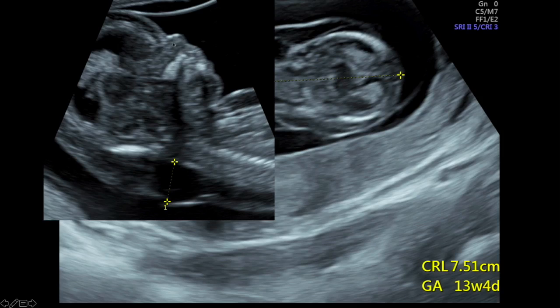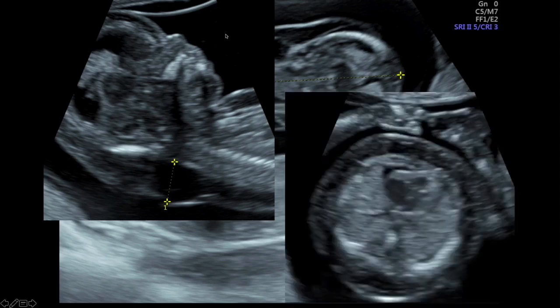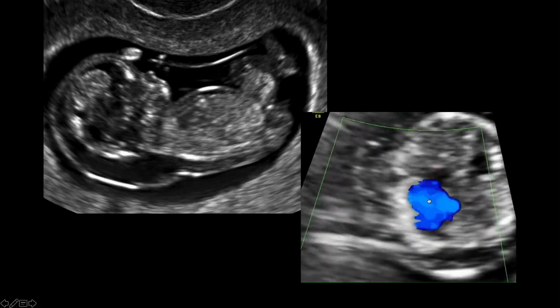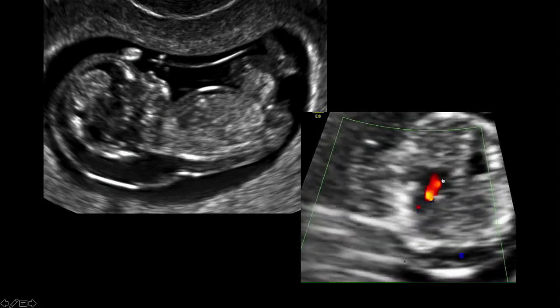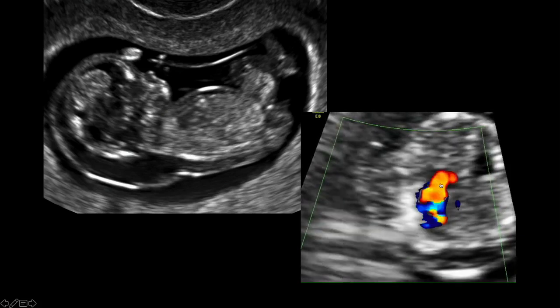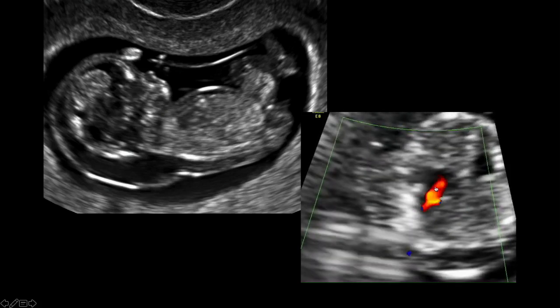You can see it's missing a nasal bone right here. And you can see that there's a heart abnormality. And in this case, there's AV canal where the regurgitant flow going back, this is the atria here, through the common AV valve going back.